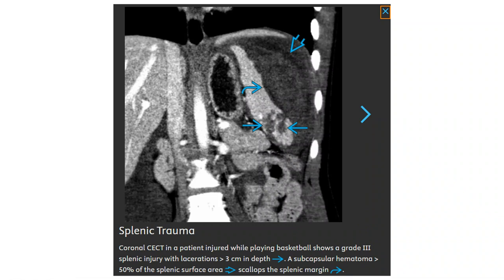This is a contrast CT in a patient injured while playing basketball, showing a grade 3 splenic injury with laceration 3 cm in depth. There is a subcapsular hematoma involving 50% of the splenic surface area, scalloping the splenic margin.